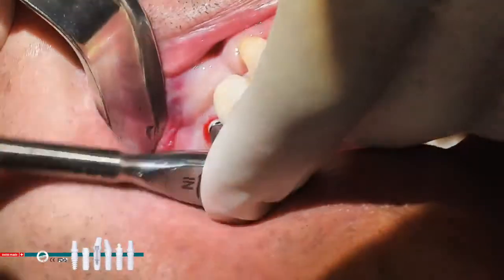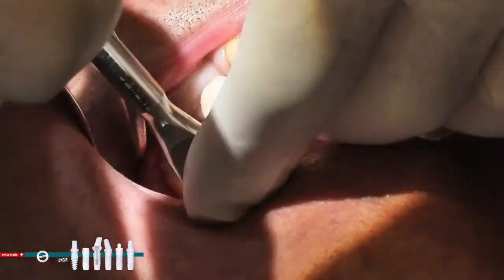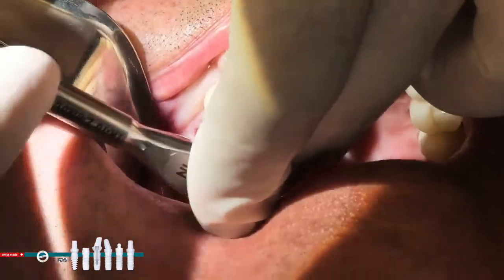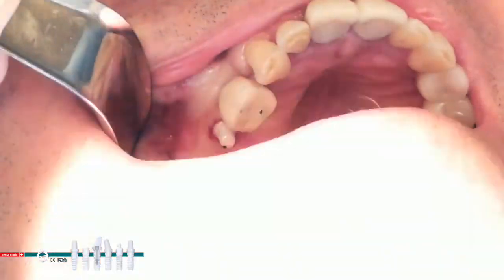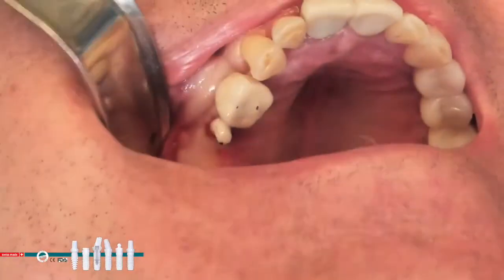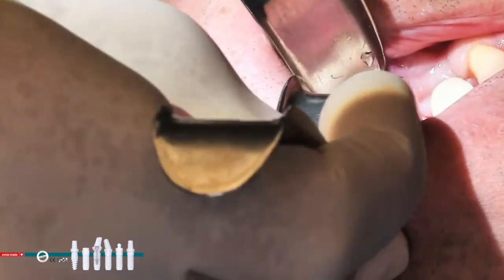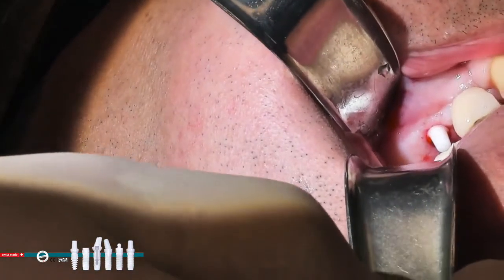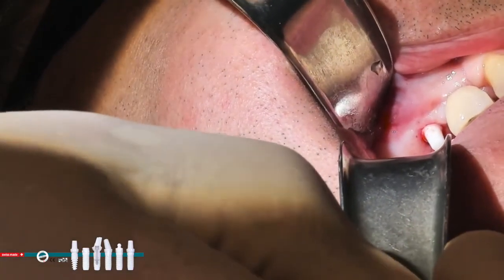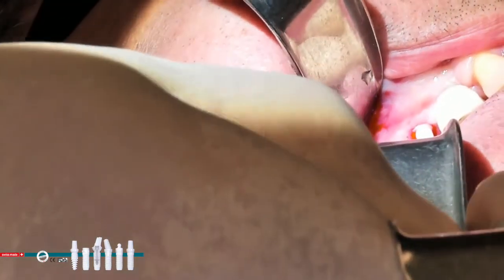And you take it to the gum level, flush at the gum level, or you can do it about 0.25 or half a millimeter subgingivally if you like. And you can bring the flat surface facially, and you have the patient bite down to check the bite. You can see there's enough clearance. Can you see that? A little bit down on your hand, if you could. Perfect. Beautiful. You can see the clearance there. Wow. You can see it's parallel. It's occluding with the opposing tooth.